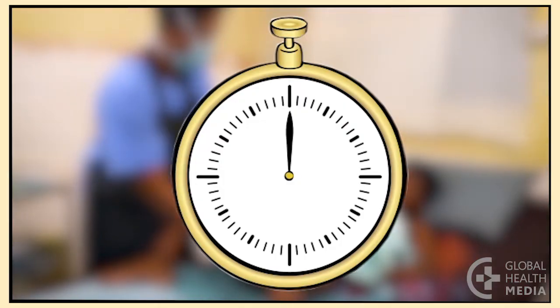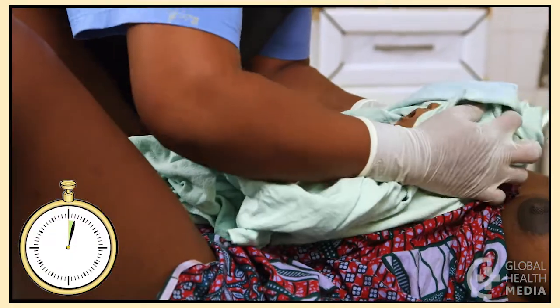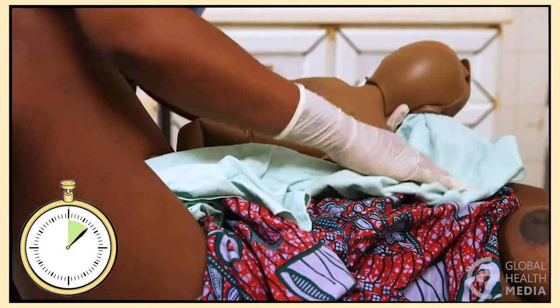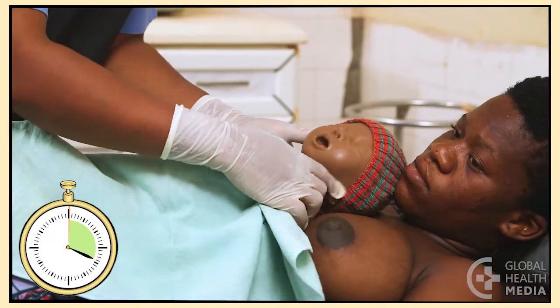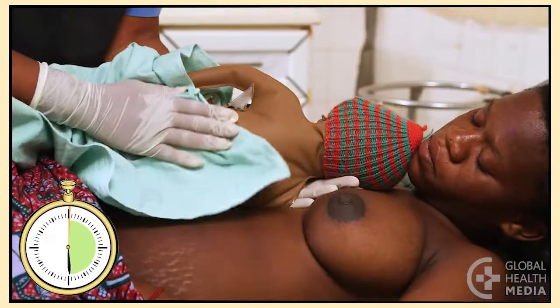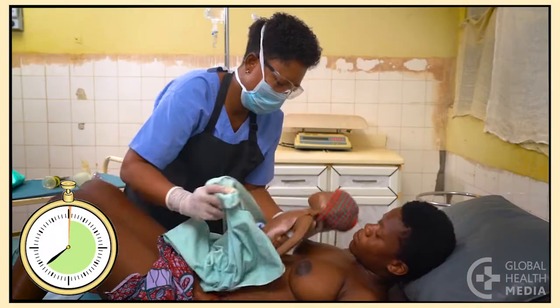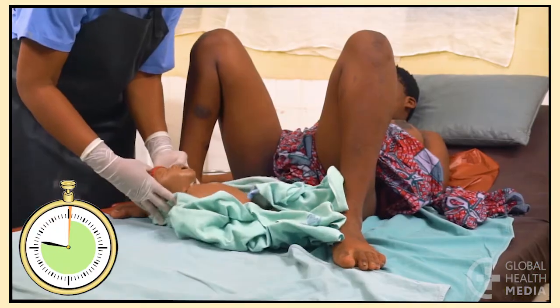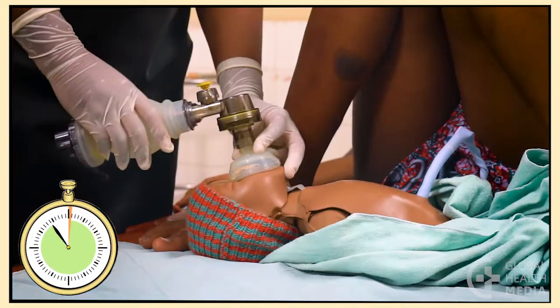The golden minute starts at birth. Place the baby on the mother's abdomen. As you quickly dry the baby, you'll notice that she hasn't cried. Now change to a dry cloth and observe — she's not breathing. Slightly extend her head and check for secretions, then stimulate the baby. She is still not breathing. Now move her to a firm surface, position her head, place the mask and make a tight seal, then start your ventilations.